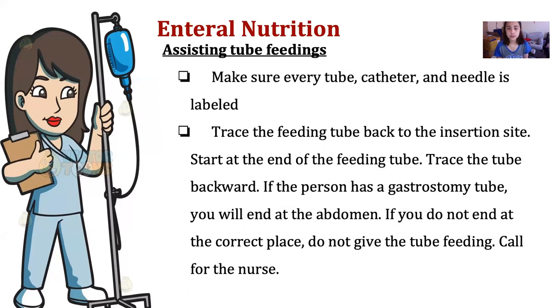Next is, make sure every tube, catheter, and needle is labeled. Dapat lahat merong nakalagay na name, date, okay? Kasi nag-expire din yung mga tube feeding and catheters na yan. So, we should always put an expiry label so we will know if it's expired or not.